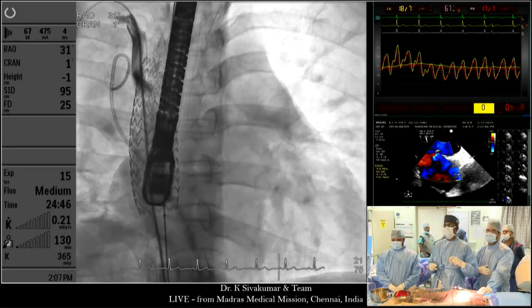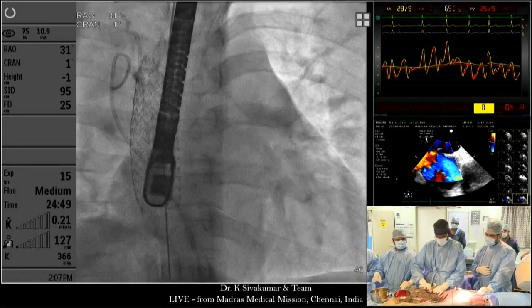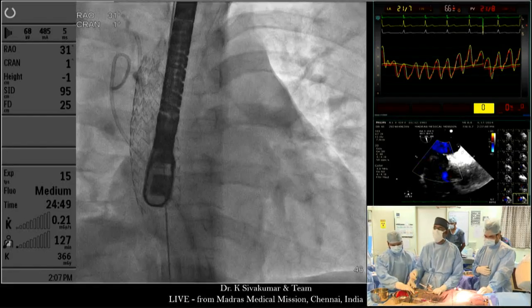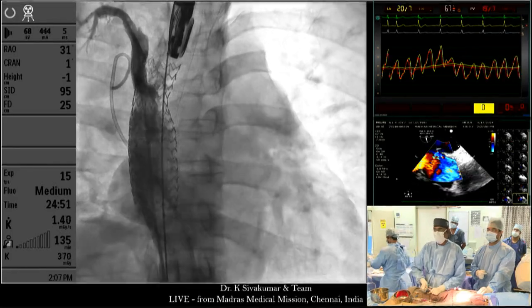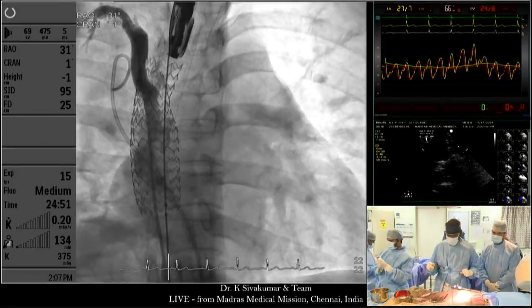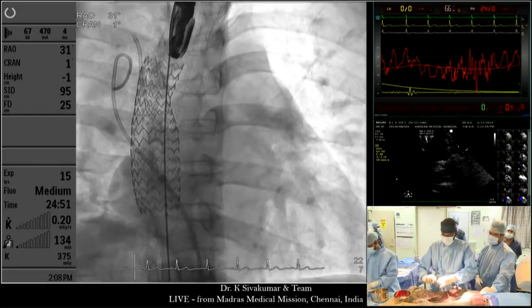So this is the right upper pulmonary vein. As you suggested, my next step will be, without the guide wire, to make a second injection to show the pictures far better. You can just dilate the strut into that vein. Yeah, that small balloon, 8 millimeter balloon, just dilate that strut and should be okay. So now this right upper pulmonary vein is allowed to drain into the superior vena cava stent. And I'm going to make one last angiogram of this main right upper pulmonary vein.